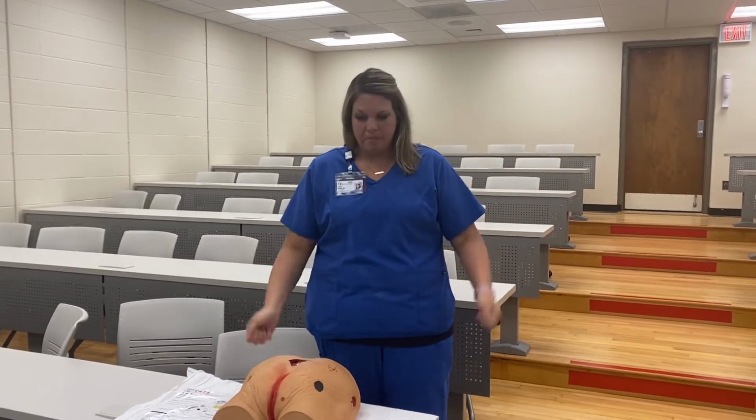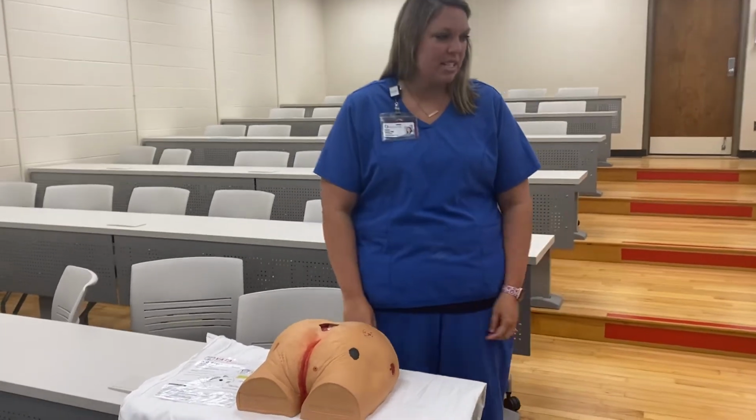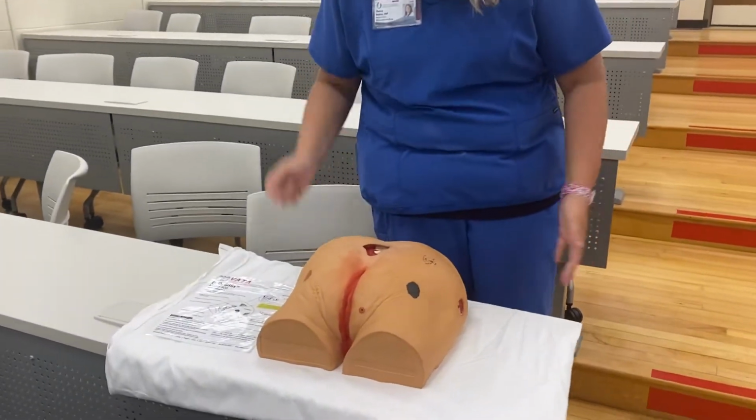lecture, and then look at some of our nursing interventions that we can implement. And we're going to talk about some of those things today, and I just wanted you to be able to see those. So part of your lab this week, you're going to be able to come to this room, A035, and put your hands on all this stuff. You're just going to walk around, socially distance yourselves, and just look at them. Okay, so the first thing we have, we're going to have a station with all the different wounds we have.